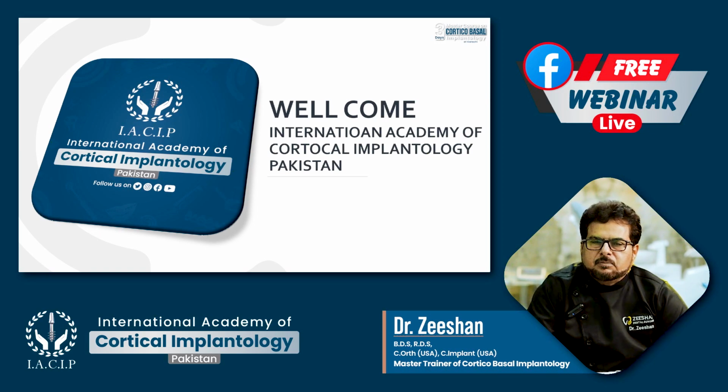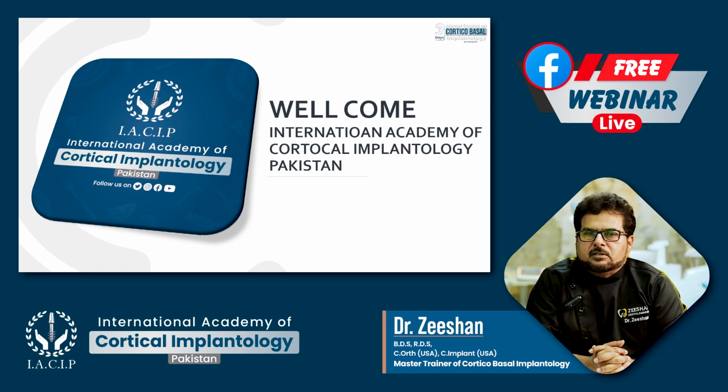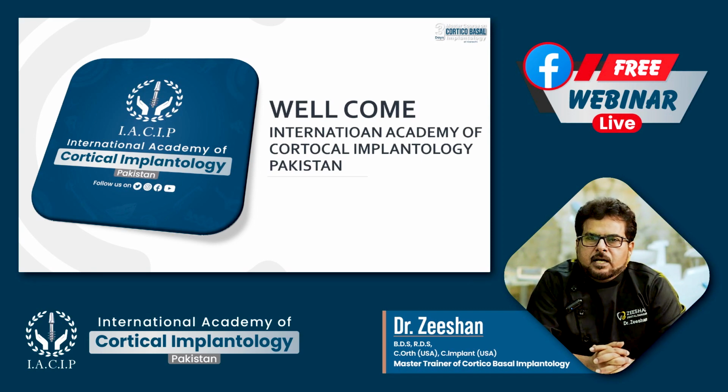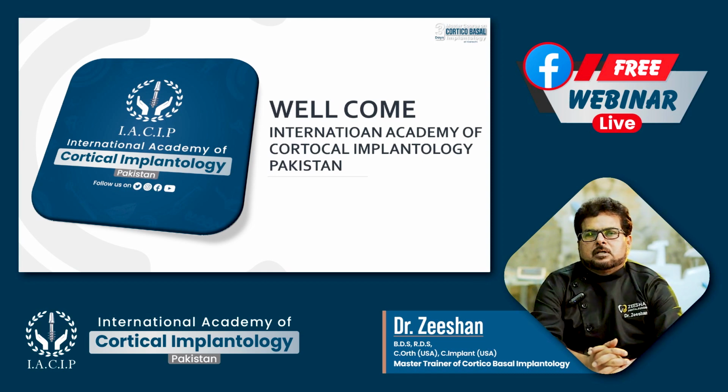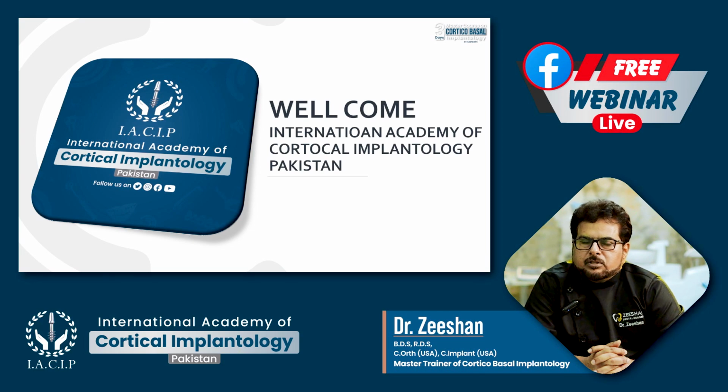Few of the implants can be in good quality bone, so we get good torque in certain implants and less torque in other implants. But if we splint all of them together and load them immediately with provisional prostheses, the highly torqued implants can help stabilize the less stabilized implants. So this is another concept of basal implantology.